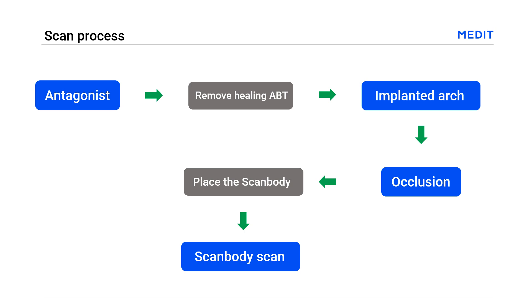Remove the healing abutment from the patient's mouth and scan the implanted arch, occlusion, and place the scan body in, then scan the scan body. This scanning sequence can minimize gum deformation.